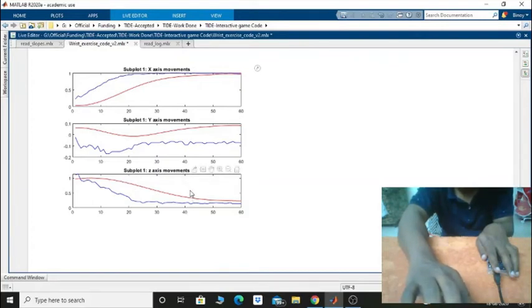We have used a Fourier series based learner to come up with this curve. It's actually a Fourier series curve fitting formula that we have come up with. So this is the result that we get from the graph. And at the same time, the data has also been uploaded to the cloud, which we will see next.